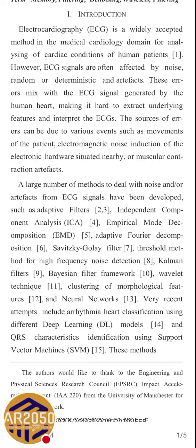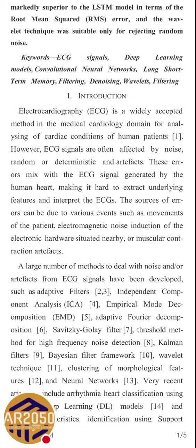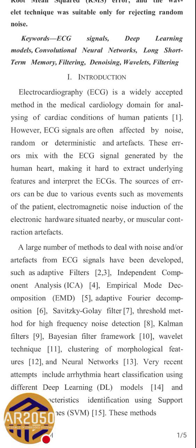But overall, what noise does is superimpose on our actual signal, or any other signal. We could talk about any time series signal, for example the EEG. We can talk about real data, which is collected with noise.